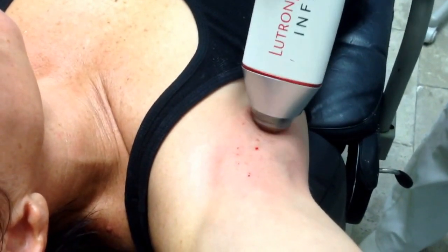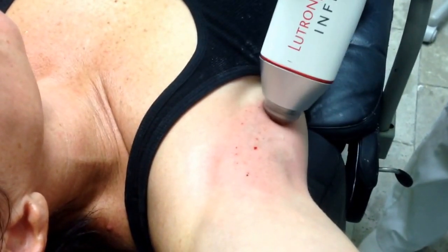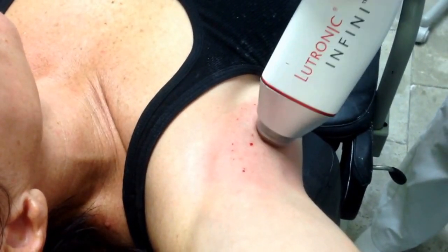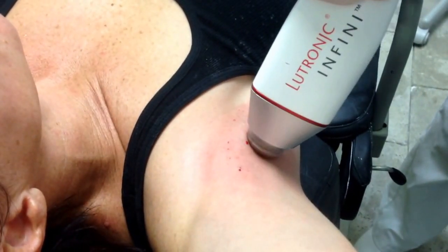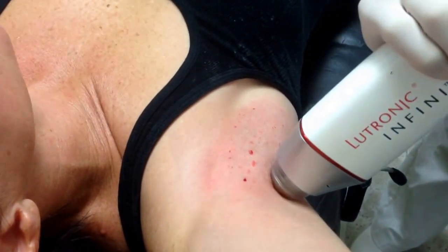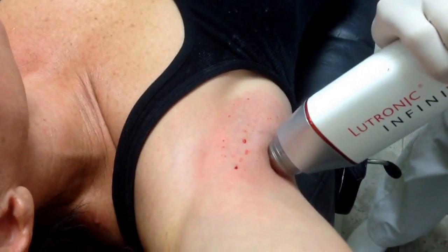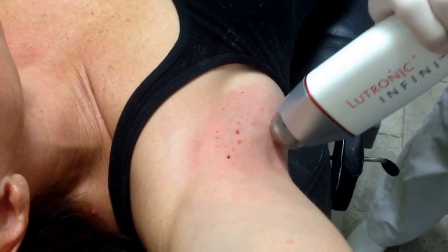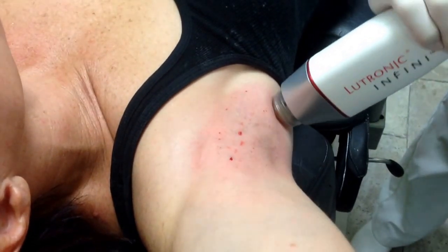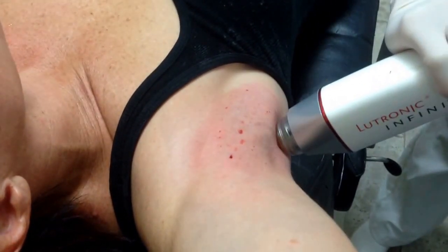The improvement happens about seven days later after the treatment. We do two passes at three different levels. It's all done under topical numbing cream without any injections. Afterwards, there's practically no swelling or downtime, and there are no restrictions afterwards.